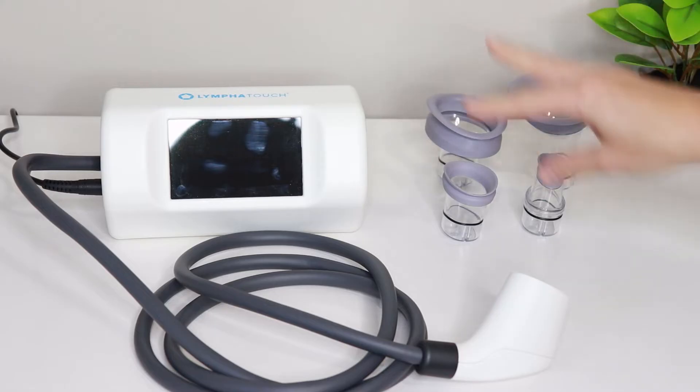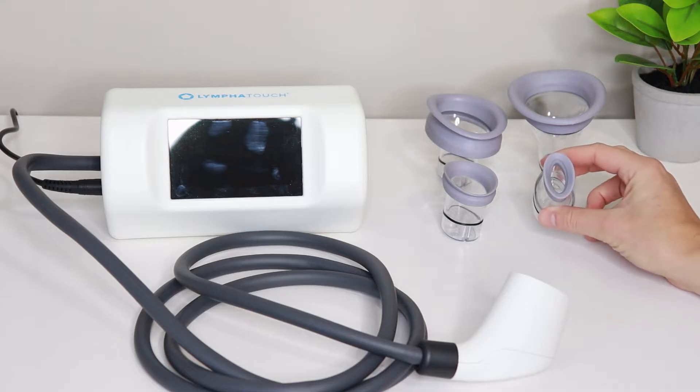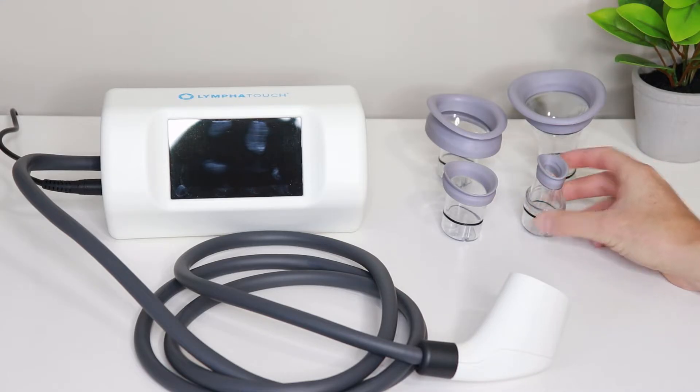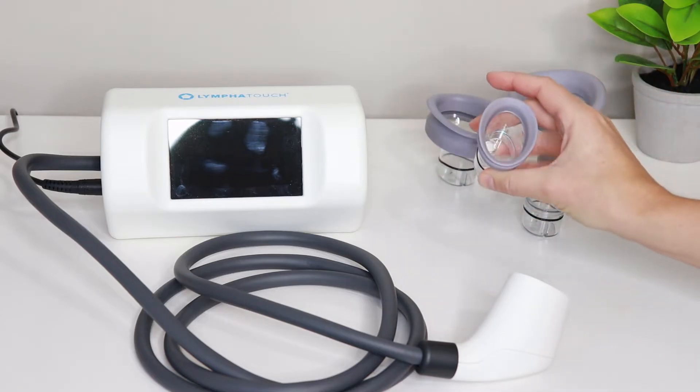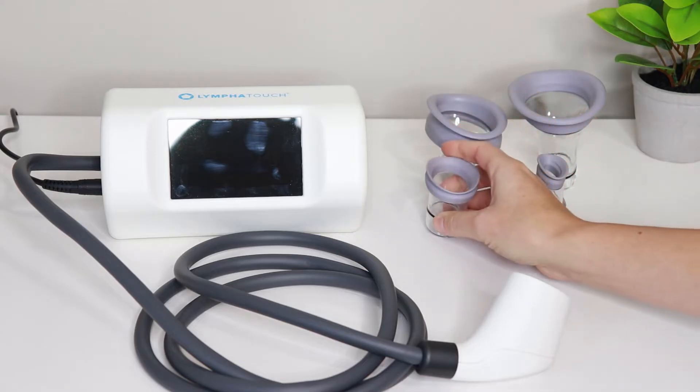The LymphoTouch has multiple different size heads — these are four of the five that they have. The small ones are great for small scars, small joint areas, the face, the head and neck. The next size up can also be used for the head and neck area, a small arm, or around the ankle.